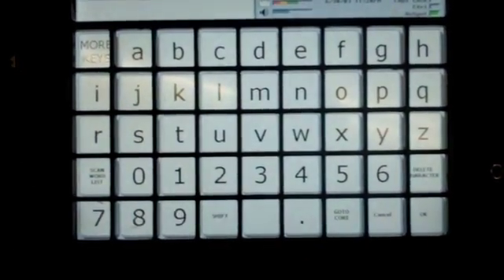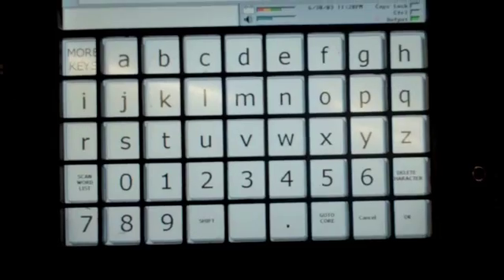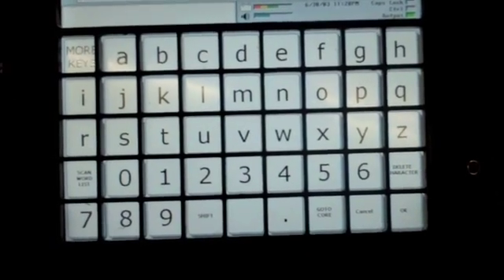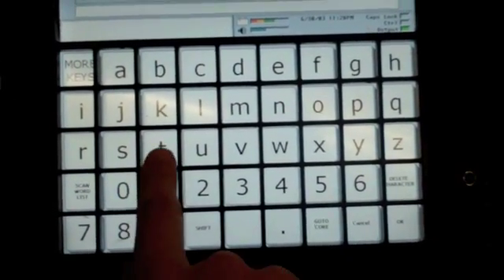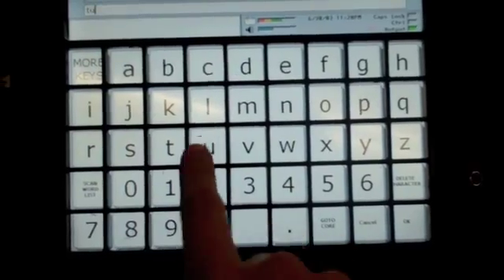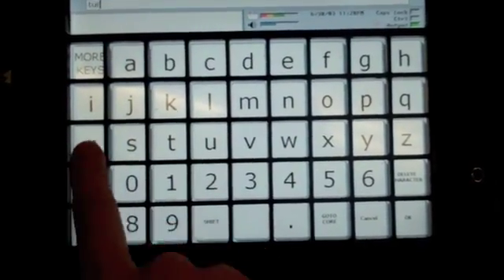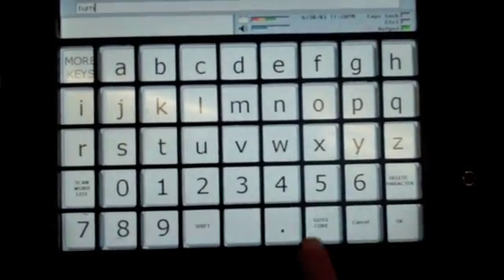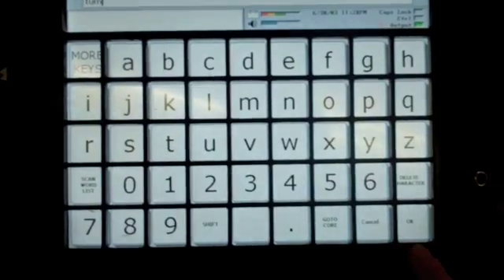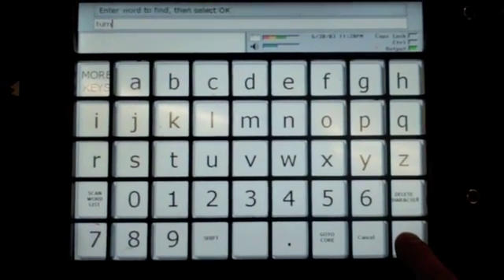From there, it will give you something to look for. For this example, I'm looking for the word turn. I'm going to go ahead and type it in, and then it says enter word and select okay. So I select okay.